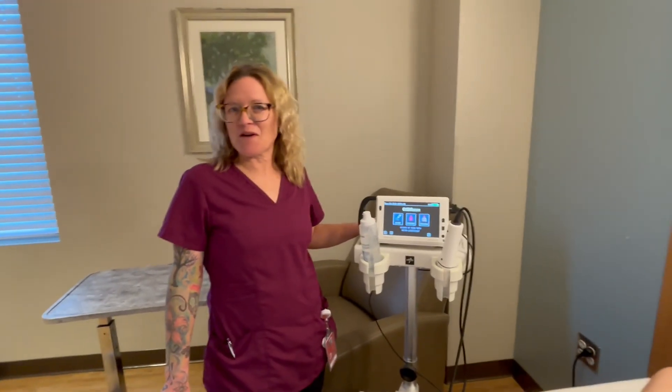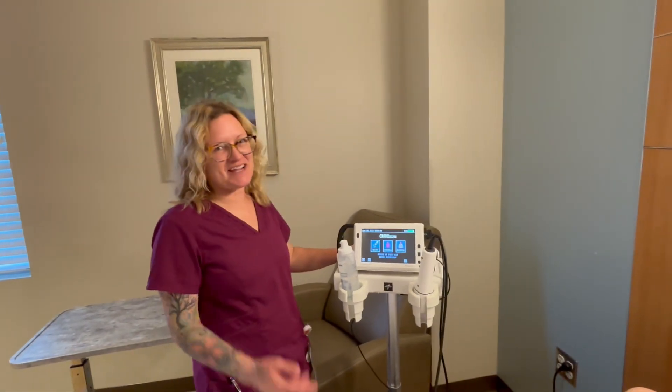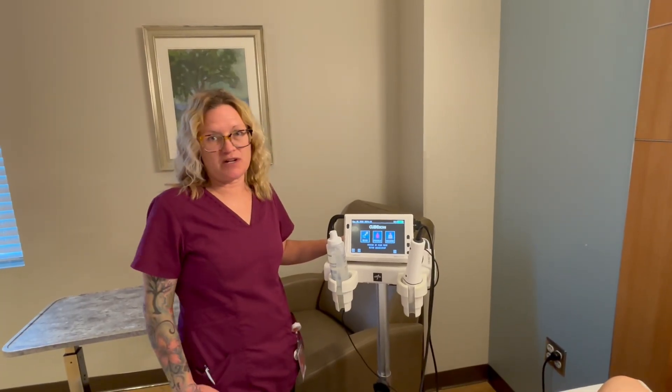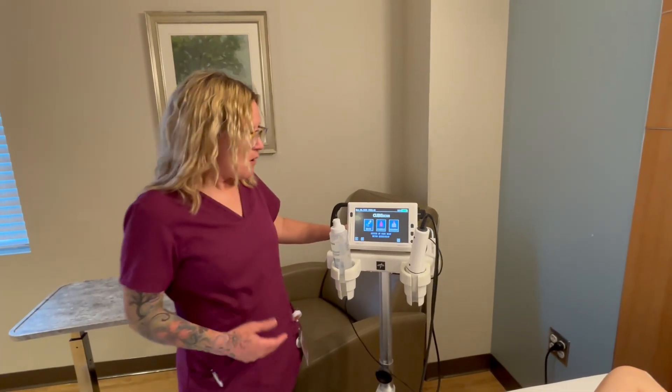Hi, Nurse Sherry here. Today we're gonna be going over how to use a bladder scanner. We use these to determine if anybody has residual urine in their bladder after they go to the bathroom or post-surgery.